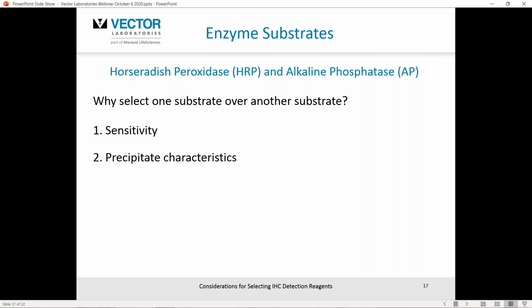The peroxidase giving more of a discrete, heavier deposition, whereas the alkaline phosphatase more of a diffuse, more of a translucent to a transparent look to them, which may be advantageous if some of the underlying morphology and architecture is very important. Maybe you're trying to avoid high levels of endogenous enzyme activity. You're struggling with blocking a lot of peroxidase for whatever reason, a highly vascularized prep. You can simply sidestep that and go with an alkaline phosphatase system.